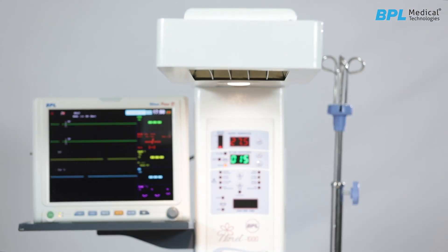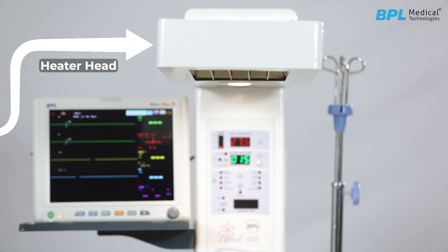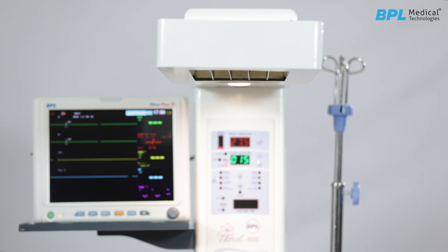At the top is the heater head. It uses a quartz heater element which is housed within a parabolic reflector. This heater element generates far infrared heat which is easily absorbed by the cornea and does not affect the retina.